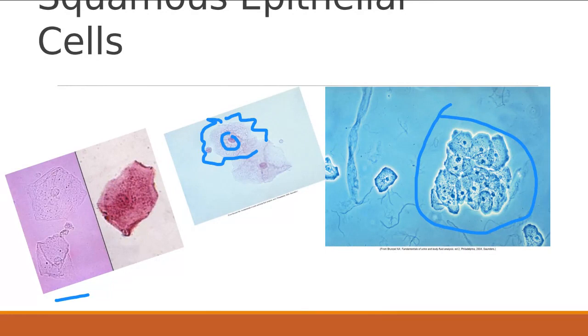This is normal. Like I said, a lot of times it's from contamination. So it's not significant. It's just kind of an external contaminant. It's not a bad thing that it's there. Okay, I don't want you to think it's a bad thing. It's there, and you'll see it in pretty well every type of urine that we do.